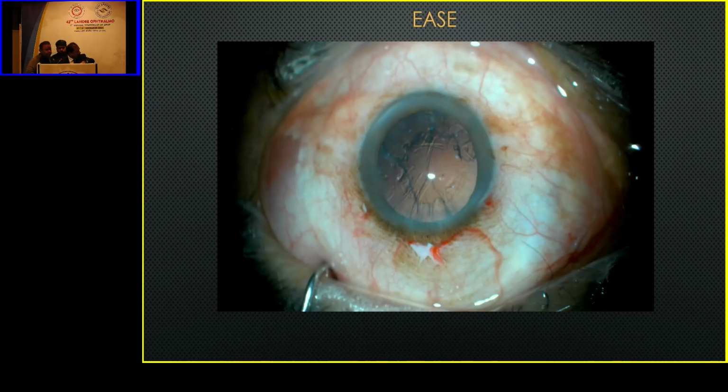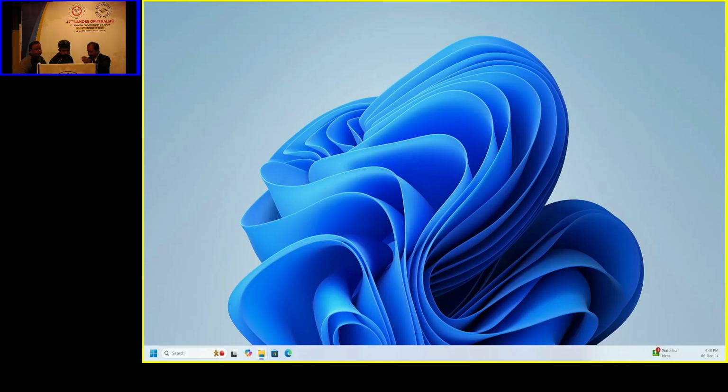It does not mean I don't do YAG. I do a lot of YAG lasers. But in certain cases, it's better to avoid. I 100% agree that YAG is a very dangerous tool. It produces a shock wave, and the shock wave is not good for the eye. So I would also recommend that for a person who has had a lens in the eye for 2, 3, 4, 5, 20 years, and you want to clear his capsule, you do it with a 23 gauge cutter.